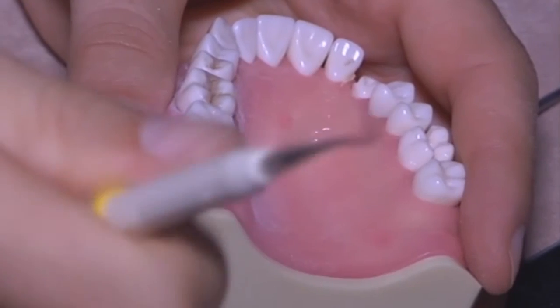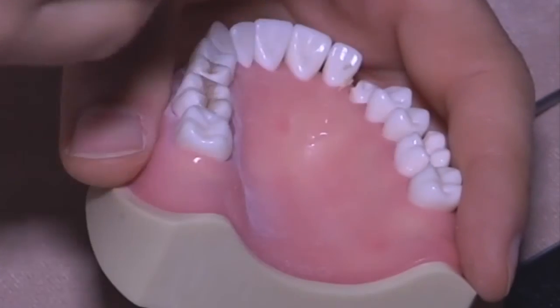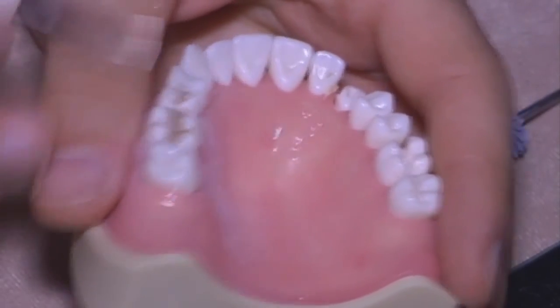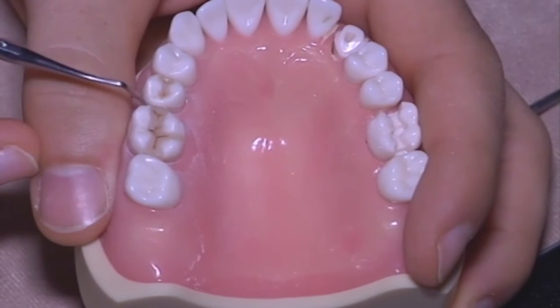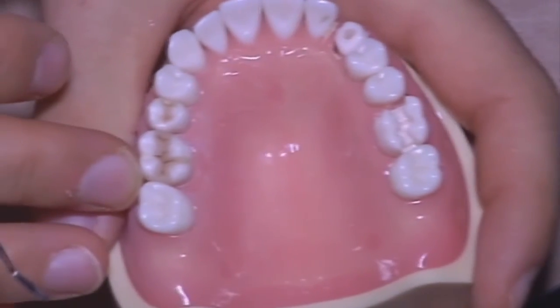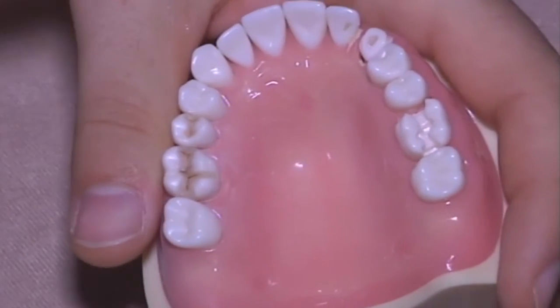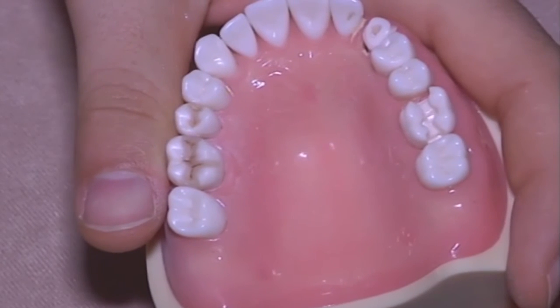correction after occlusal control. And this is the step I hate above all, because after this, in reality, 1 hour has passed, you are working for 1 hour on the same teeth, and once you finish, you just want to push that patient away from your office.